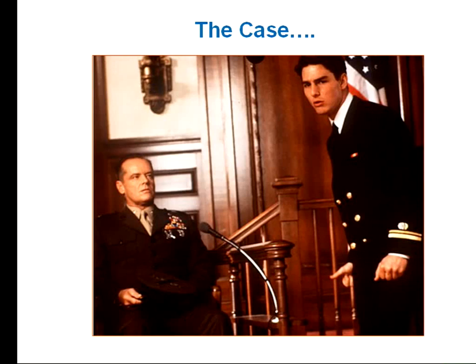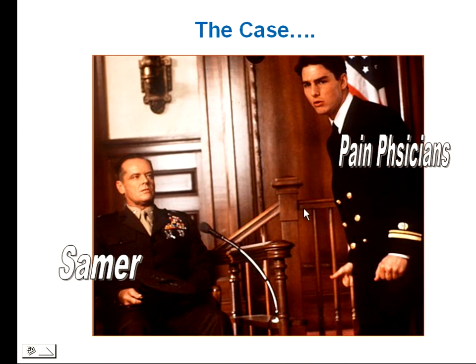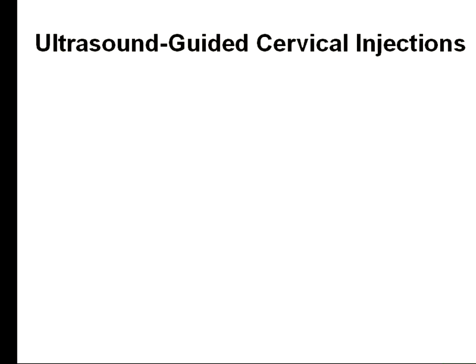The case. Unfortunately, I'm this old guy, and everyone else in the pain field, smart guys, of course, they are this young man. So if I want to promote ultrasound, to convince someone who is being introduced to ultrasound for the first time, it would be something like an intercostal block, a peripheral nerve block like lateral femoral cutaneous, or a stellate ganglion block. And I think by the end of the presentation, you should get a sense of why I really like to use ultrasound in neck injections in general, specifically for cervical sympathetic blocks.